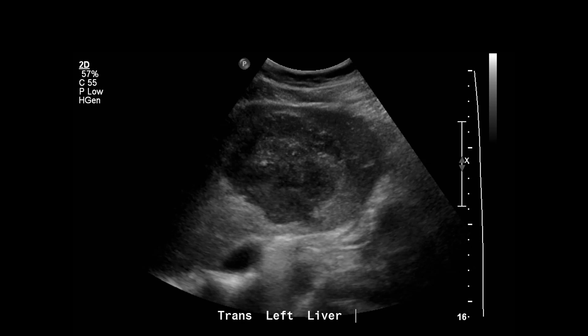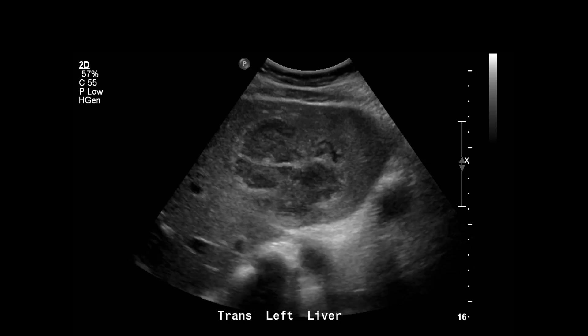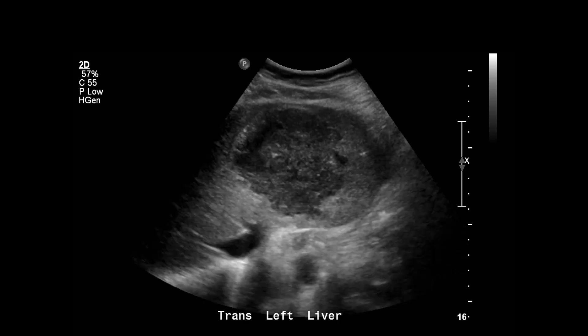This patient started with an ultrasound of the abdomen and you can see there's a large collection here in the left hepatic lobe. It's got irregular echogenic rim-like margins with heterogeneously hypoechoic echoes internally. There's also some irregular echogenic septations that at least partially extend across the collection.